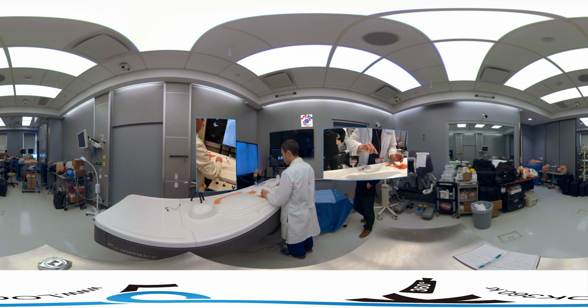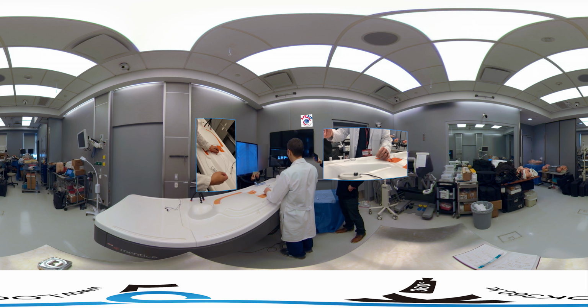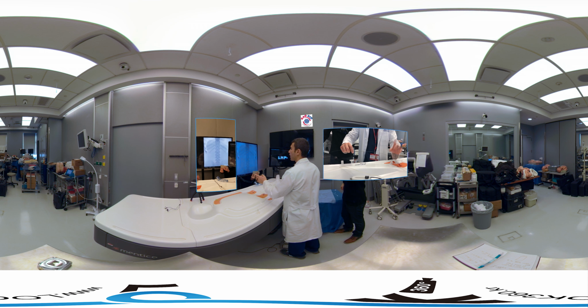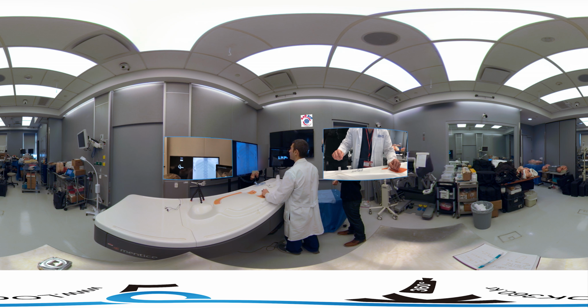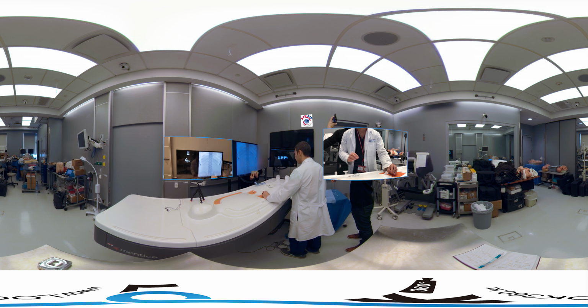So first we'll get our guide wire up, and for the simulator we use a very stiff guide wire, but in practice you can use an Amplatz or something similar. When the machine recognizes that the wire is there, you'll see it light up on the screen, and then we'll use X-ray here to be able to see the wire on our monitor. And you can see that we'll bring the wire up to the level of the diaphragm.